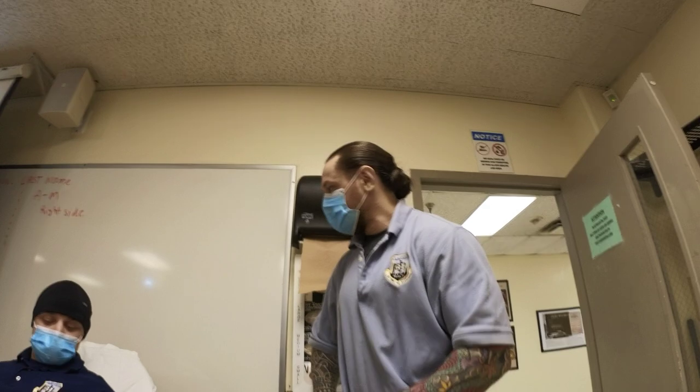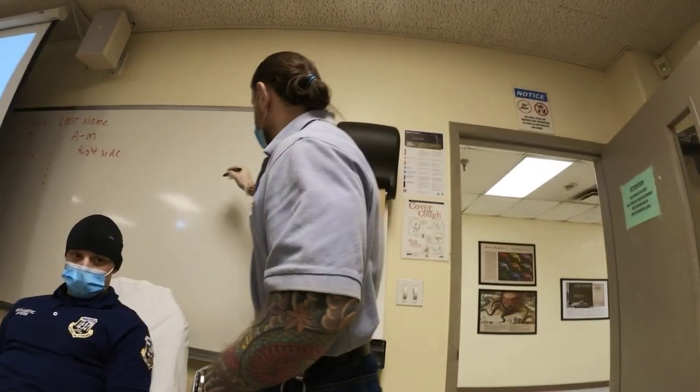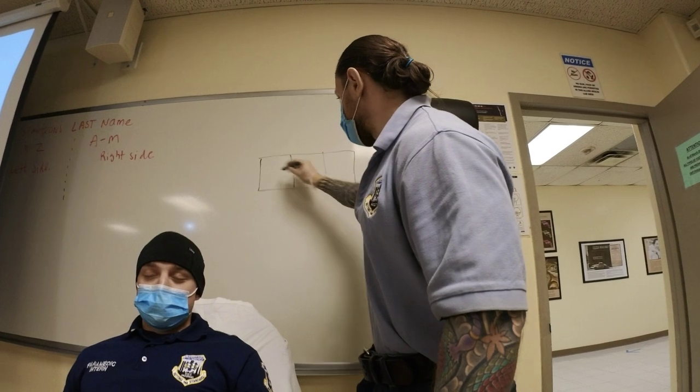Go through application of the leads to get a 12 lead first, then we're going to do a 15 lead EKG. In terms of your 12 lead EKG, the format is the same. When it prints out, it doesn't matter if you're using Zoll, LifePak 12, or MRX, you have these grid lines.